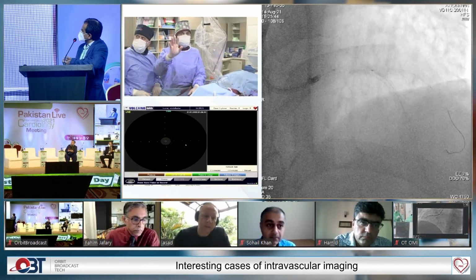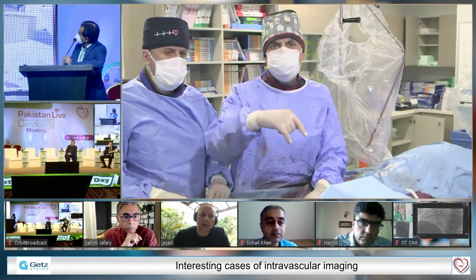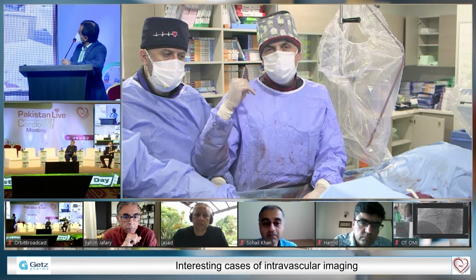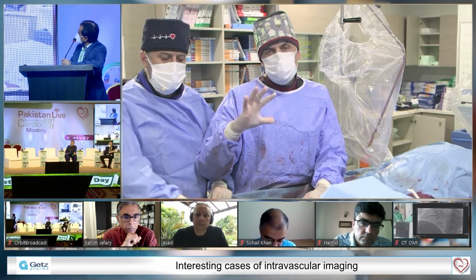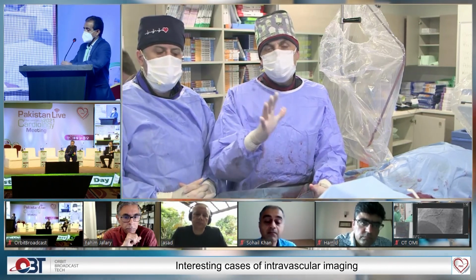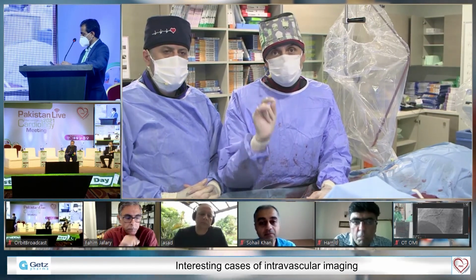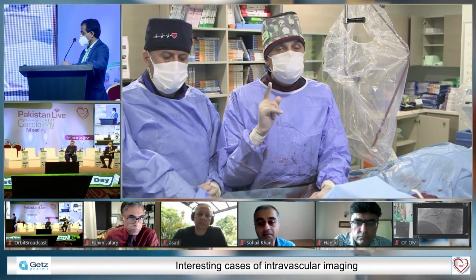So, Asad, thank you very much for your comment. What I learned from this case myself, since there was a time limitation, I couldn't see the collateral well before the case. Number one lesson I have: we have to see the previous images in great detail. We have to see where the retrograde comes from. We have to spend some time for that.